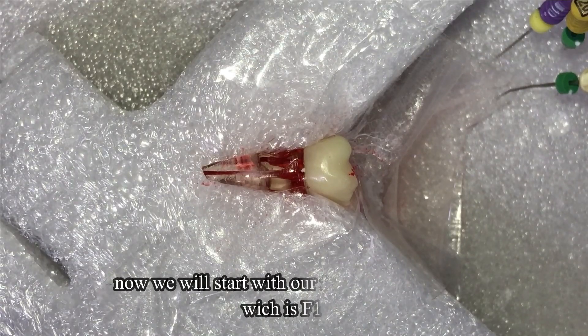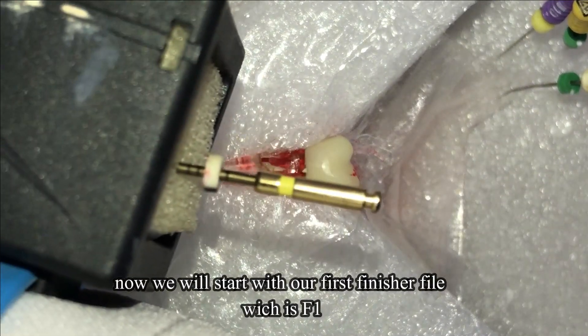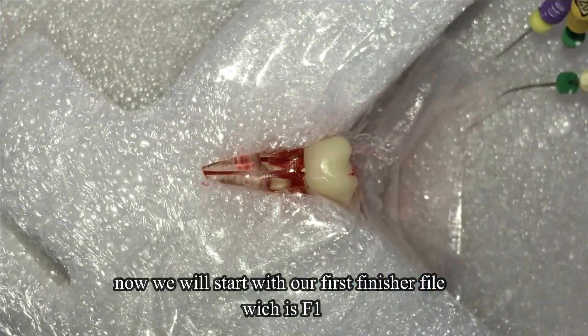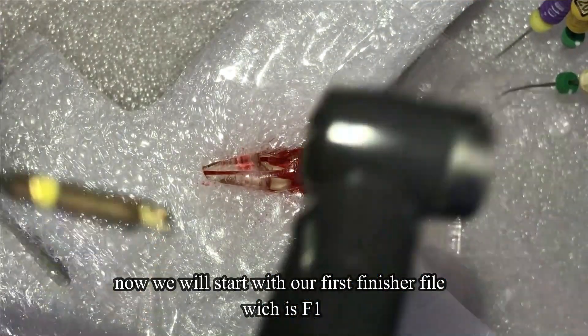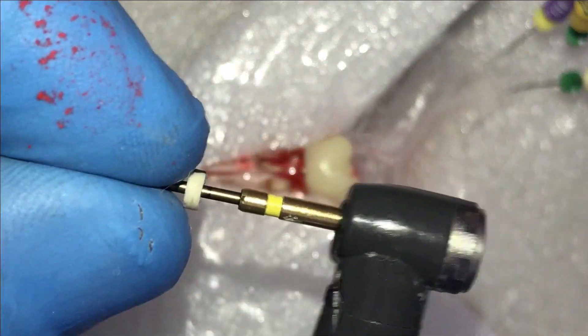Now we will start with our first finisher file in the ProTaper Gold system, which is the F1 file.